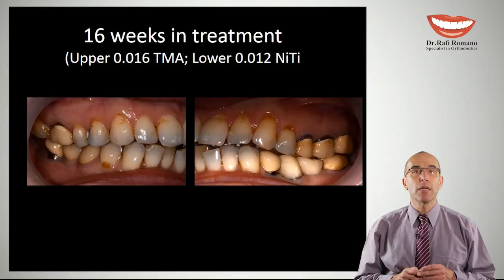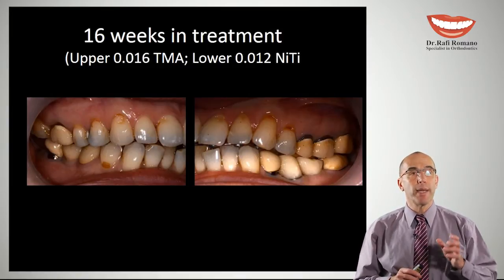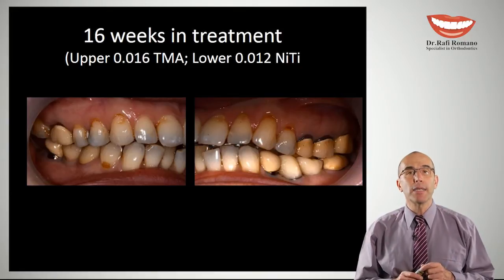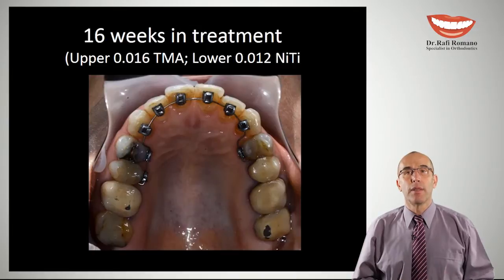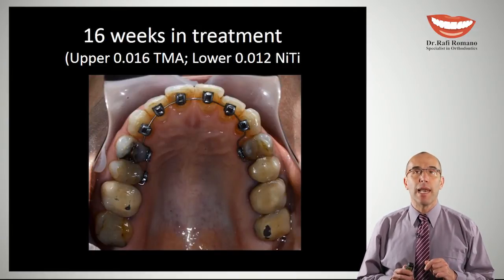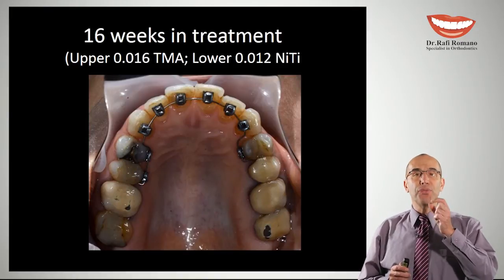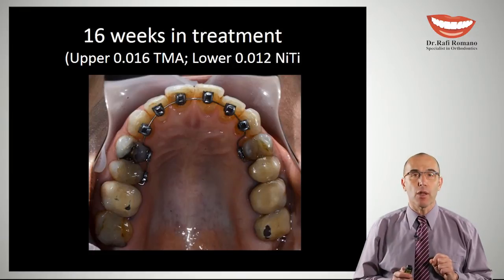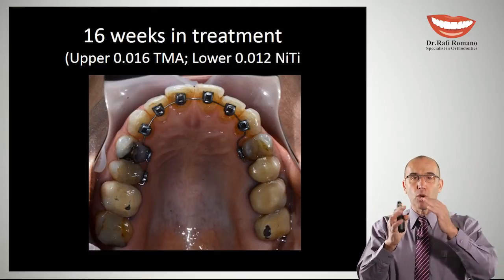Now she has some temporary restoration on the implants, so we can get more nice occlusion in the right and left that stabilize the arch for us. Here she is in 16 weeks. Alignment is progressing. Still, the wire is not fully engaged in the anterior slots, meaning that I still have place for rotation to happen.